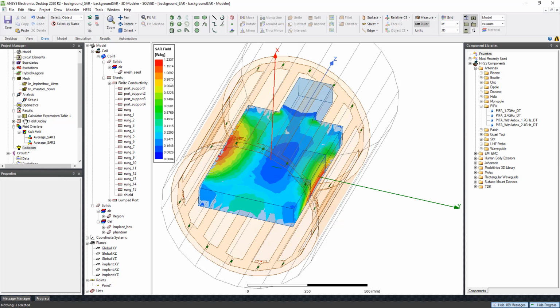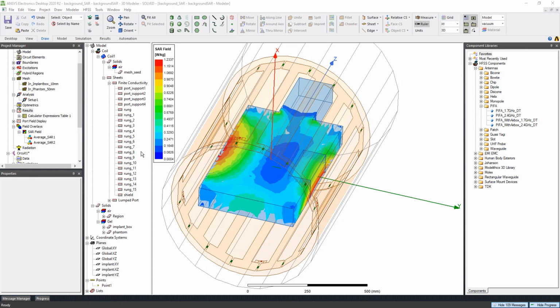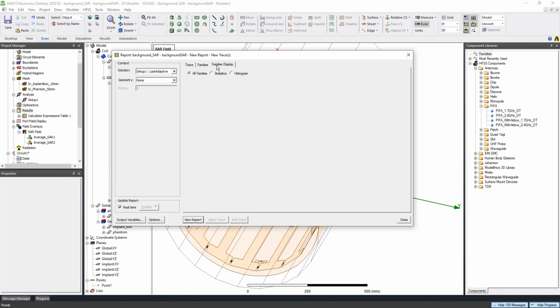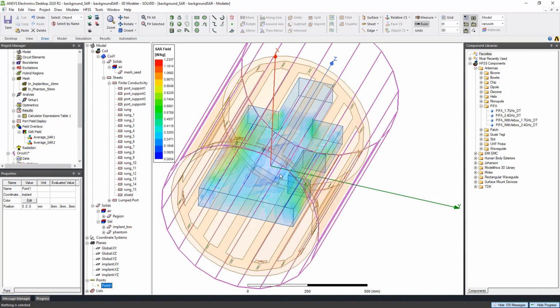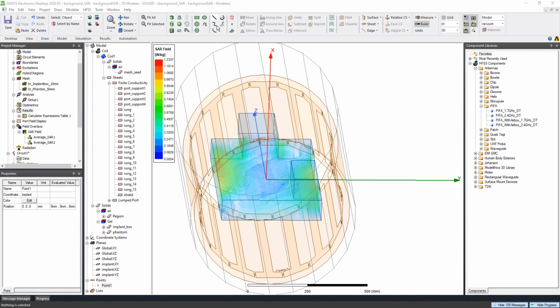Or if you just want to check out the maximum SAR value, then you can go to the results, right click, create field report and data table. So now we have this, and you can just plot at a single frequency. You need to choose a point. Here I think the point we have is at the center. You can draw a line.